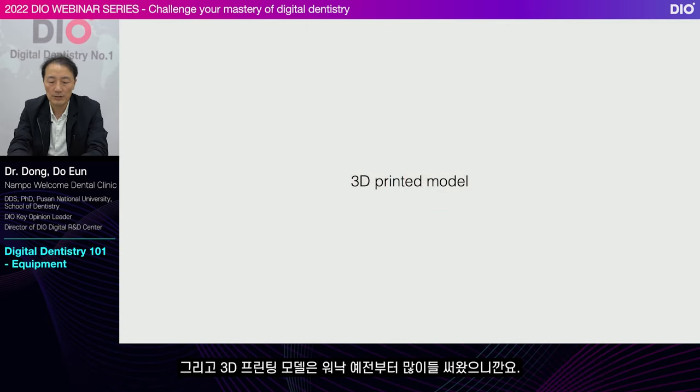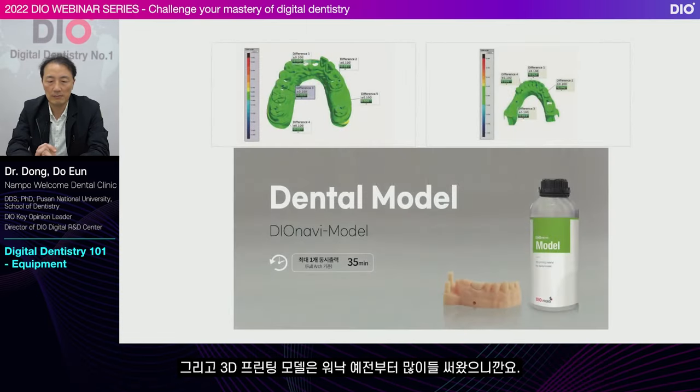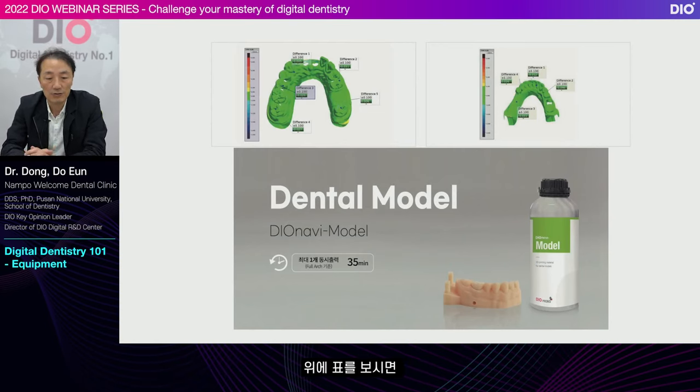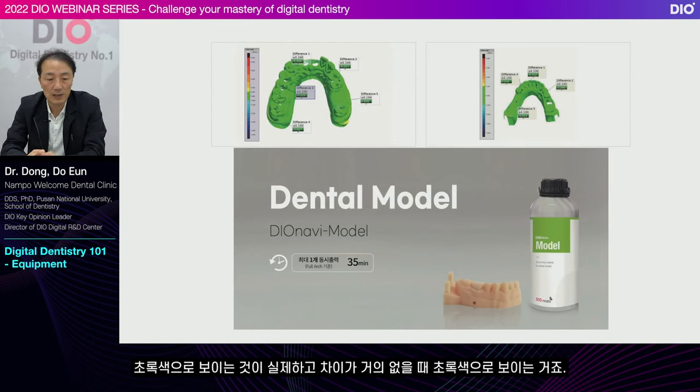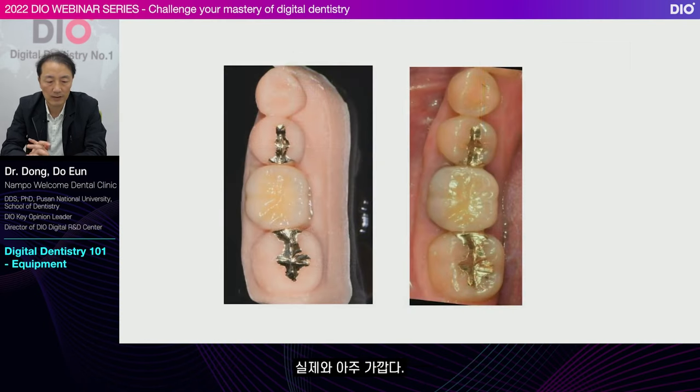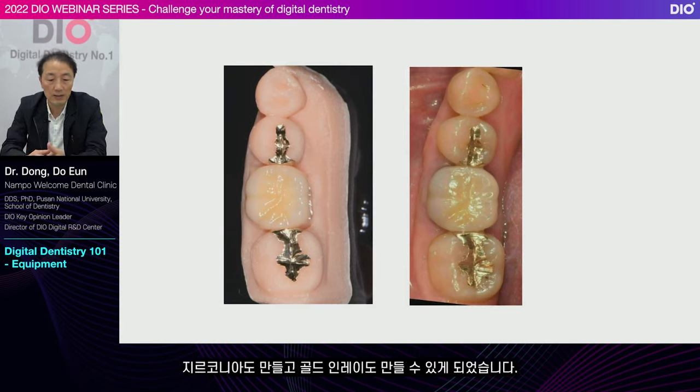Also, since 3D printing models have been used for a long time, what's important in the printing material for models is how similar the design is to the real thing. If you look at the table above, the green color indicates that there is almost no difference from the real thing. It's called the trueness, referring to how similar it is to the real thing. It's very close. With a scanned model in a digital form, you can make a physical model and make prostheses like zirconia and gold inlay as well.